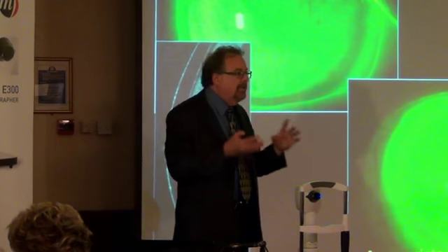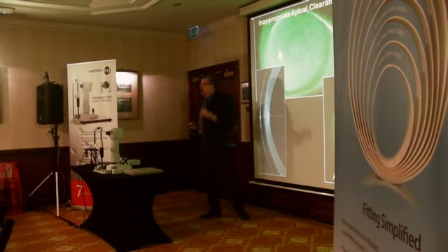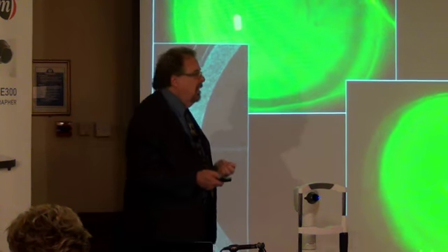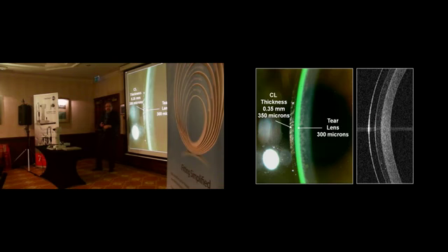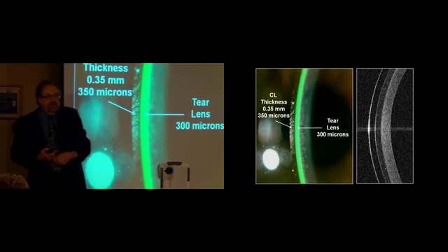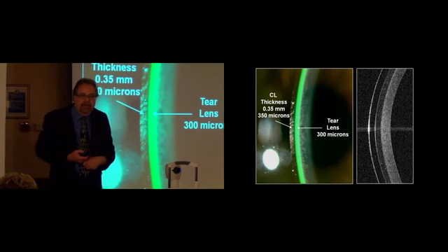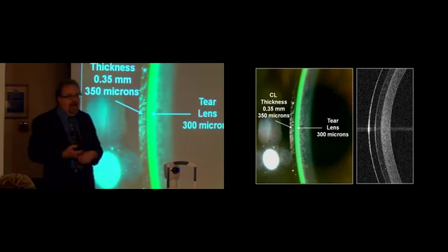So when you can see the pupil, chances are you don't have enough vault in the central portion of the contact lens. Now, how do we estimate that at the slit lamp? Well, there's a sure way to do it, and that is with optic section of the slit lamp. Such a wonderful, wonderful tool to have.